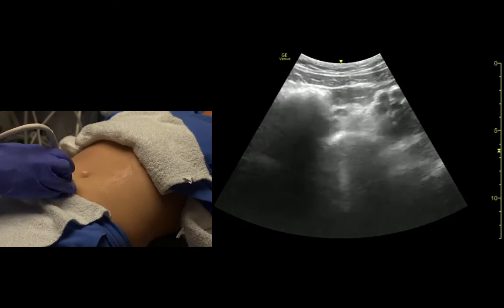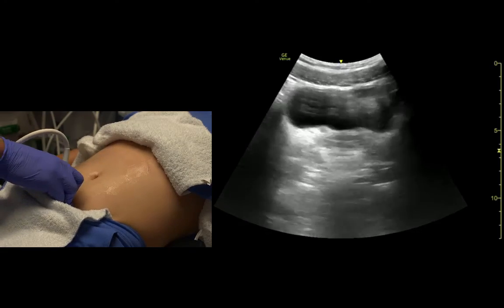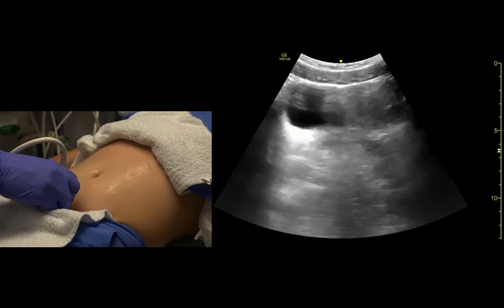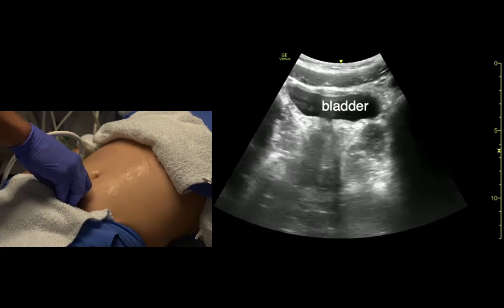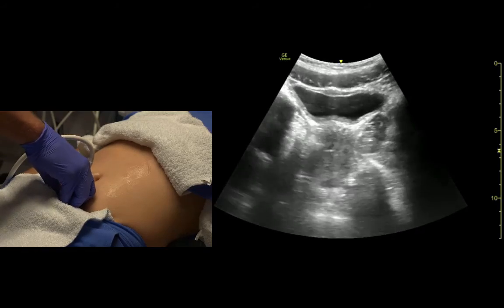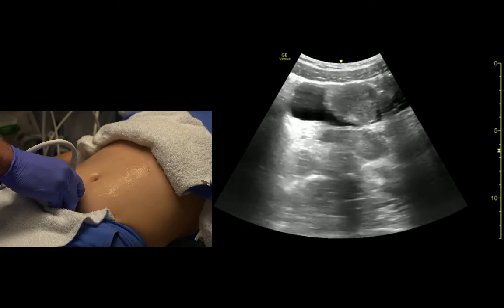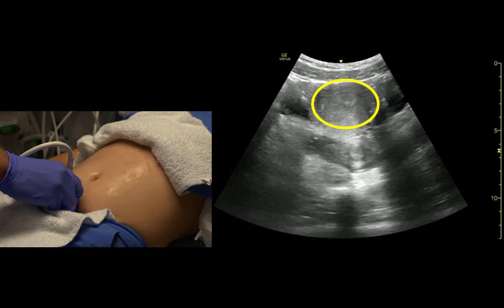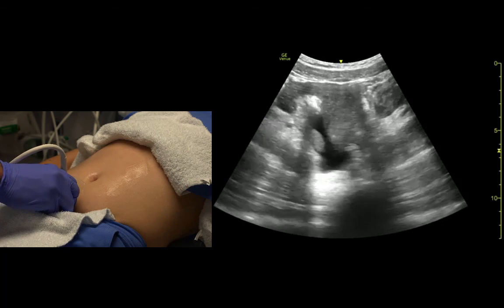Now we'll take a look at the bladder. The bladder is always a little lower than you think it's going to be. We get right above the pubic symphysis and fan towards the feet. Here's the bladder — it's not a circle; it's kind of a trigonal shape. As we fan towards the patient's head in the female, we see the uterus. In this case we see a small amount of free fluid behind it, which is normal, but that's where we look for free fluid in a trauma setting.